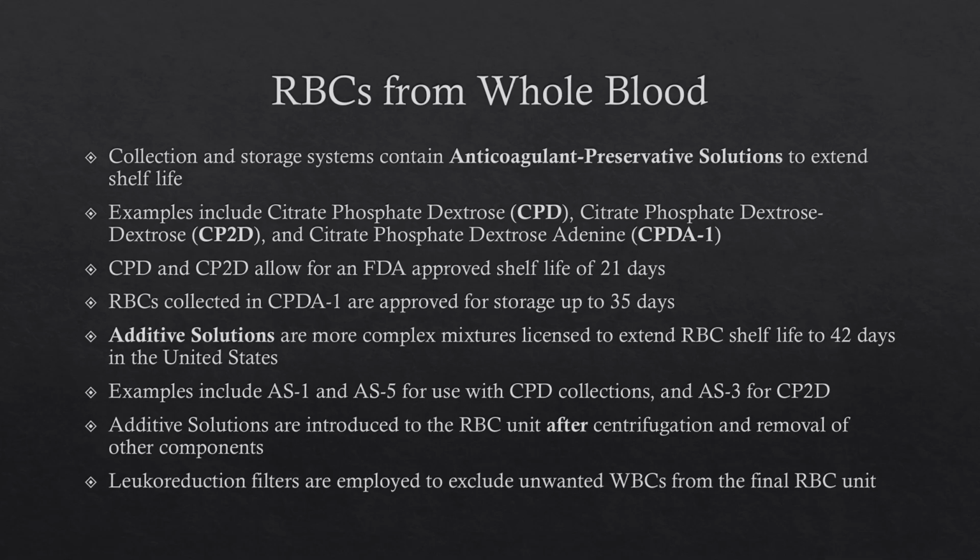This is also the point during component manufacture that a leukoreduction filter will be used. Depending on the production method, it can happen with the whole blood or the individual, separated RBC component. But either way, it's going to go through a leukoreduction filter to remove all of the unwanted white blood cells.